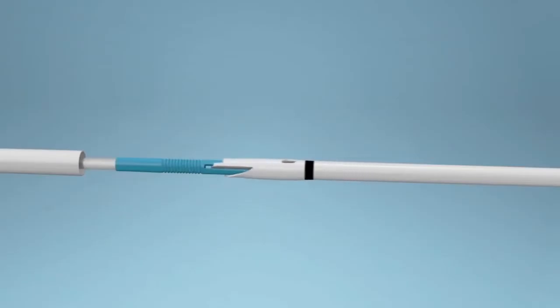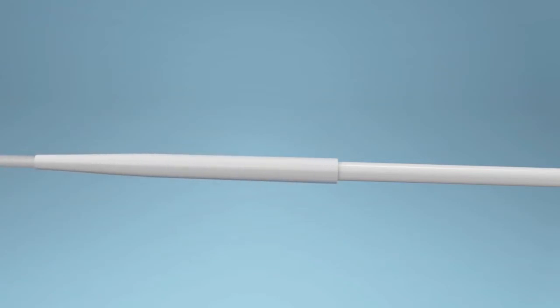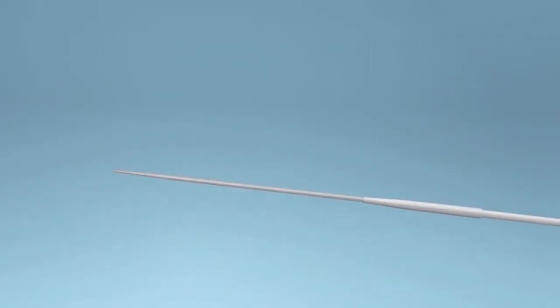Now attach the primed and clamped catheter to the tines of the tunneling stylet until the catheter tip meets the base of the tines. Slide the plastic sheath completely over the connection until it stops. If desired, bend the tunneler into a wide arc to facilitate creation of a curved tunnel. Be sure the guide wire is secure to prevent movement during the tunneling procedure.